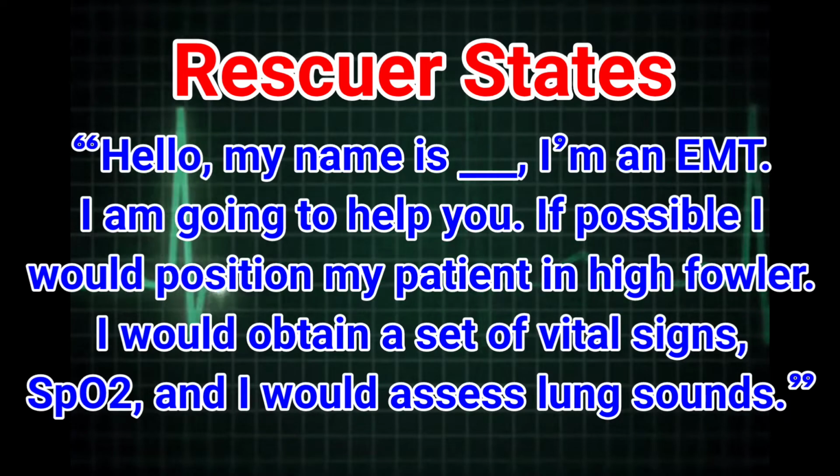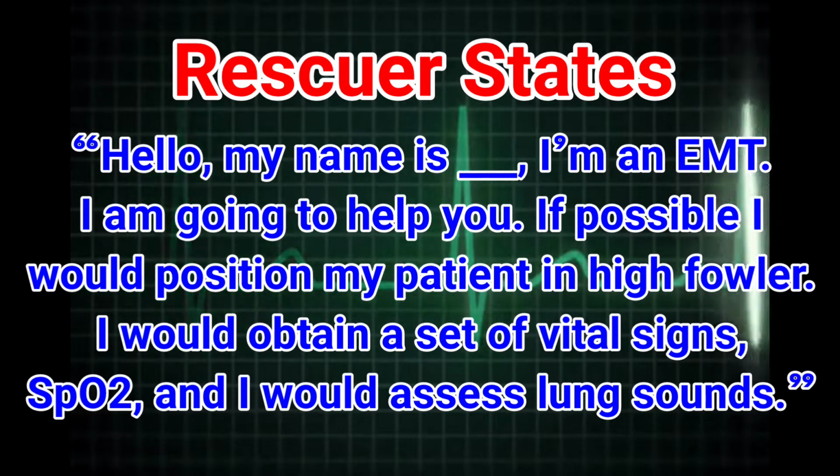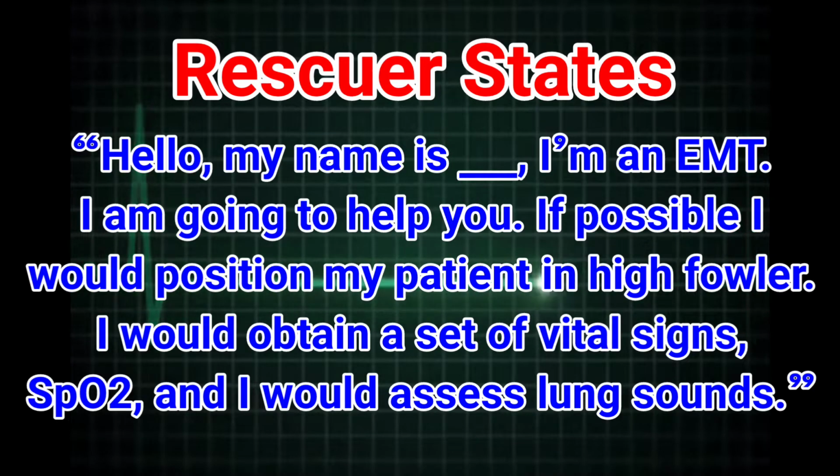Rescuer states, hello, my name is, I am an EMT. I am going to help you. If possible, I would position my patient in high Fowler. I would obtain a set of vital signs, SpO2, and I would assess lung sounds.